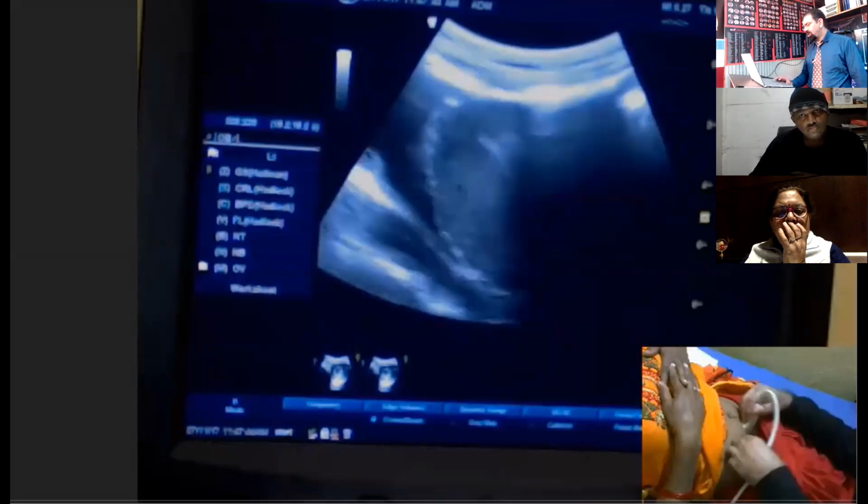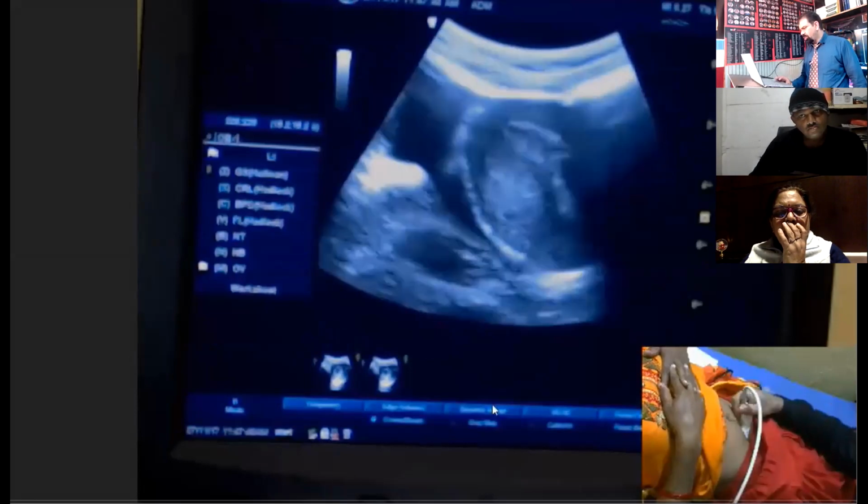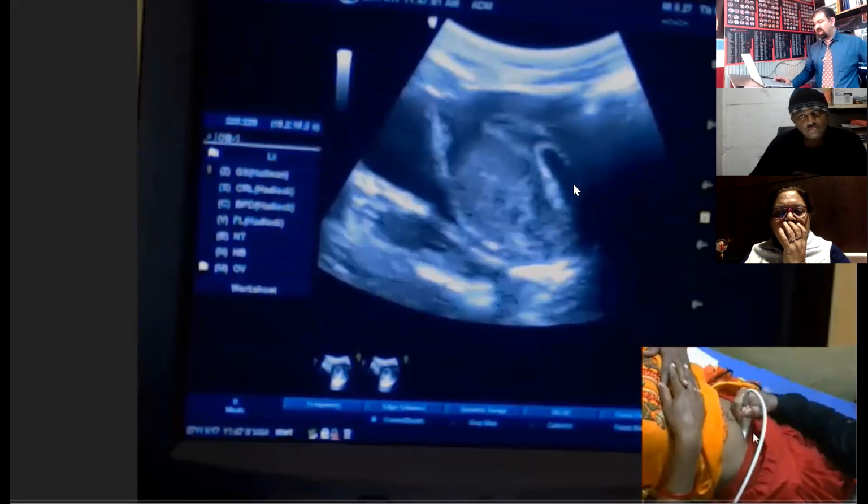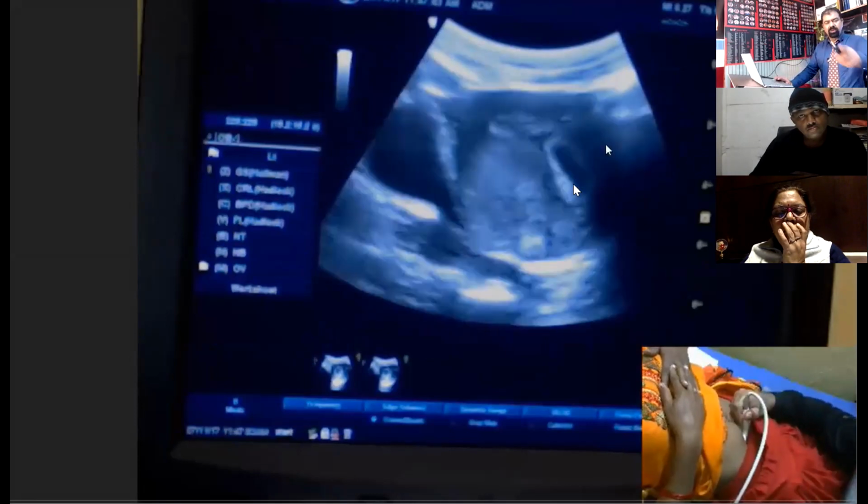Please control your background noise. Otherwise, we'll remove you from the class. Sir, double decidual sac sign. Double decidual sac. Very good. Remove that person. Not Dr. Shanti.